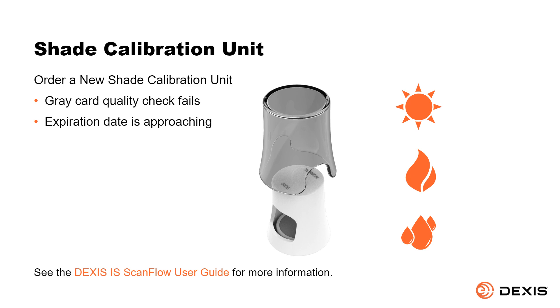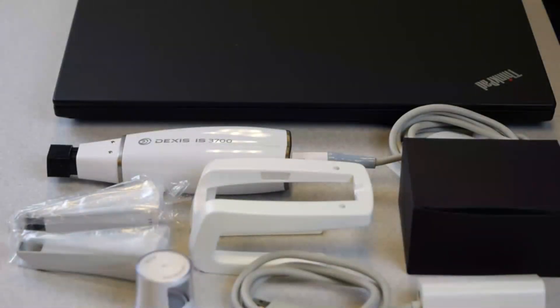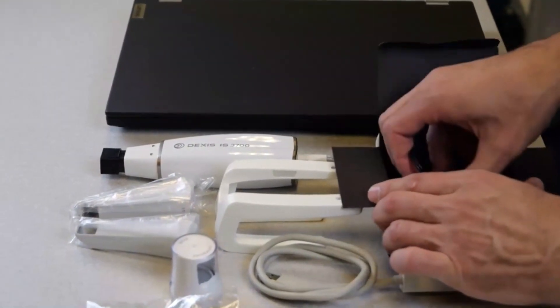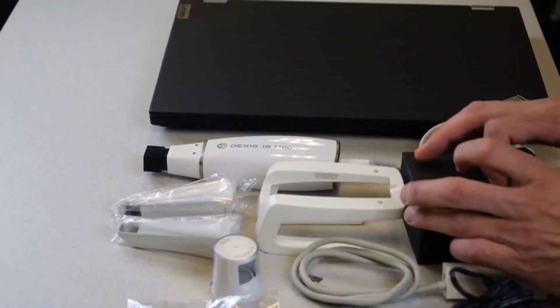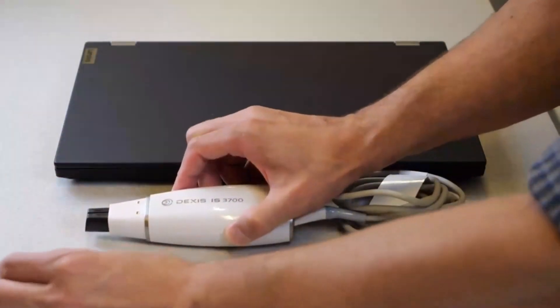See the DEXIS IS ScanFlow user guide for more information. Setting up the scanner. Remove all the items from the scanner case and place them on your workstation. Remove the power adapter from the box. Remove the protection cap and place a scanning tip on the scanner as shown.